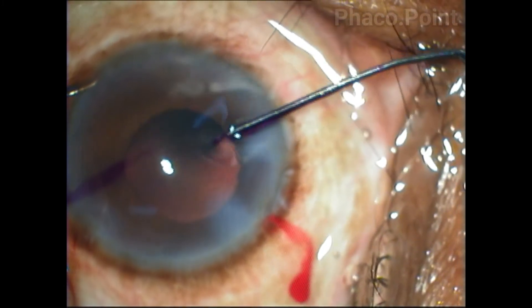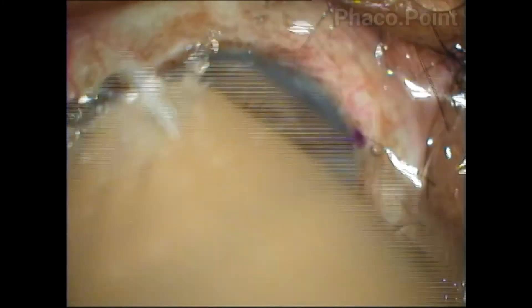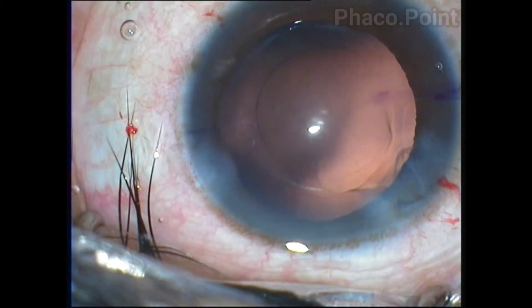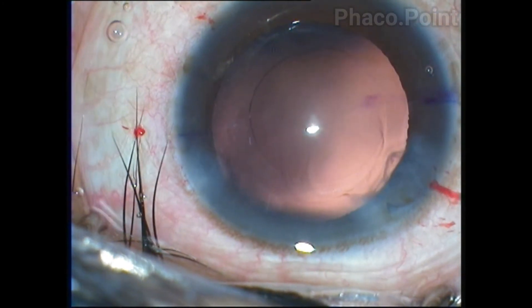This is another way of enhancing the view with blue dye: apply a little bit of blue dye and then just wash it off. You will have thin, fine blue lines because the blue ink will just go to the groove of the mark that you made and will not produce thick lines.